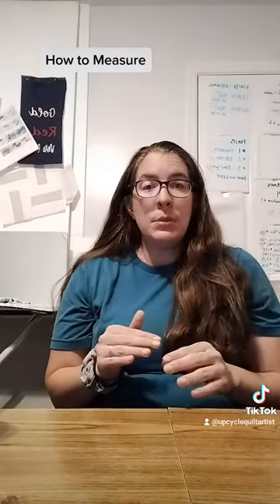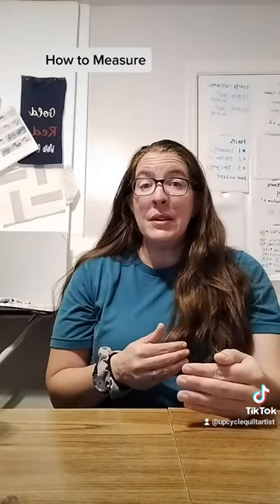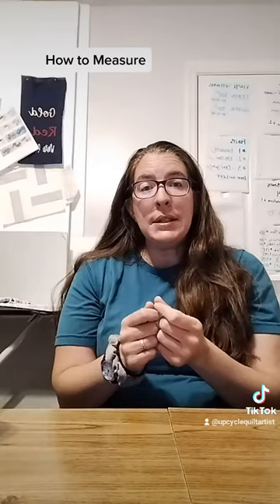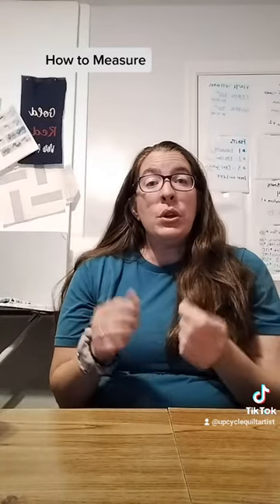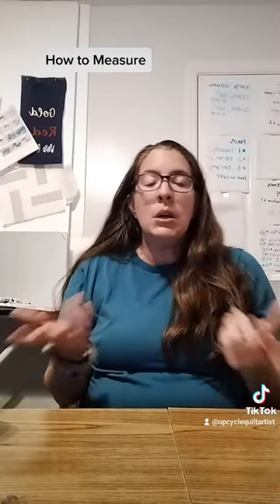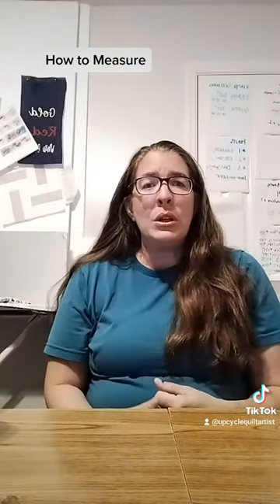It's real simple. Don't add any additional inches because I'll do that for you. So just take a nice, easy measurement. If you know you're going to wear it under clothes, you probably want to just lift up their shirt and take a measurement. But if it's over clothes, just go ahead and measure them over clothes.